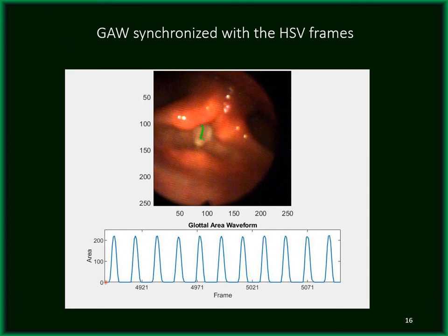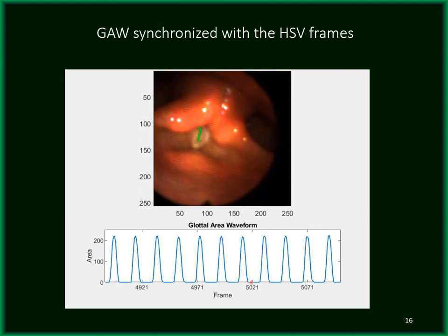Here is a video that shows the detected edges of the vocal folds along with the calculated glottal area waveform. You can see the HSV frame on the top; detected edges of the left and right vocal folds are plotted on top of each HSV frame in green and yellow colors. In the bottom of the video, the corresponding glottal area waveform is shown, synchronized with the HSV sequence.